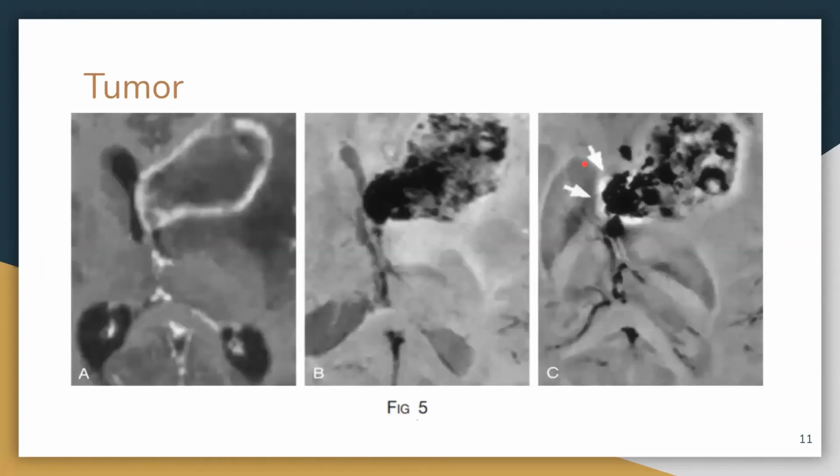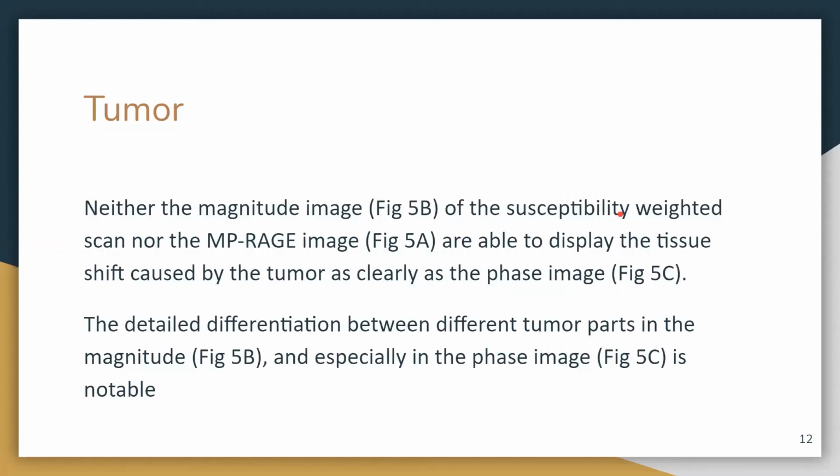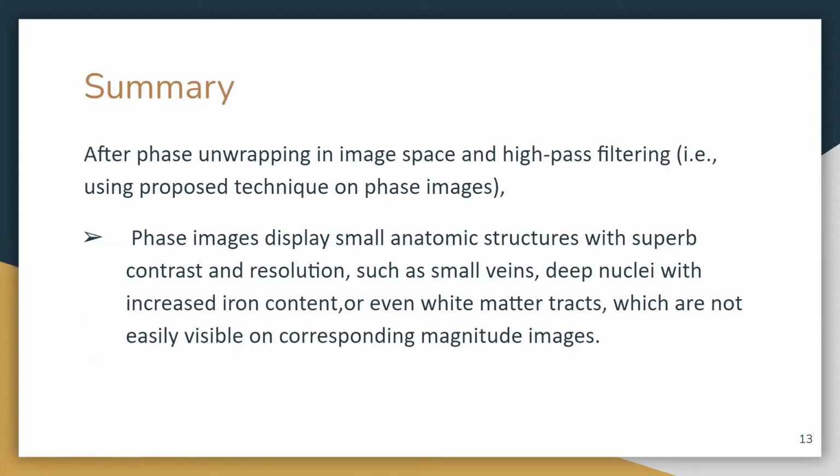So that here we can see the clear detailed shift of the tumor in the 5C of the phase image. We can distinguish the shift, which is clearly notable.